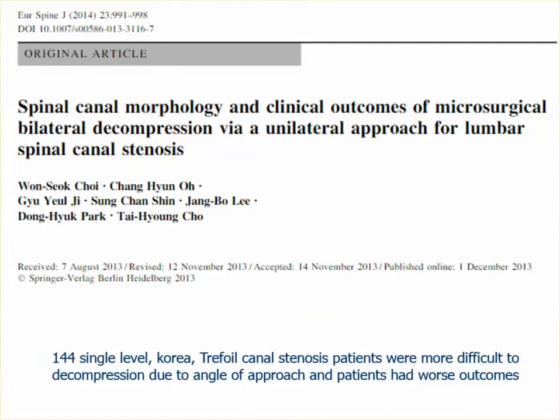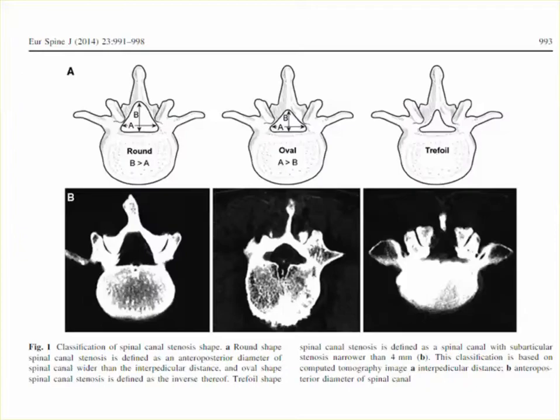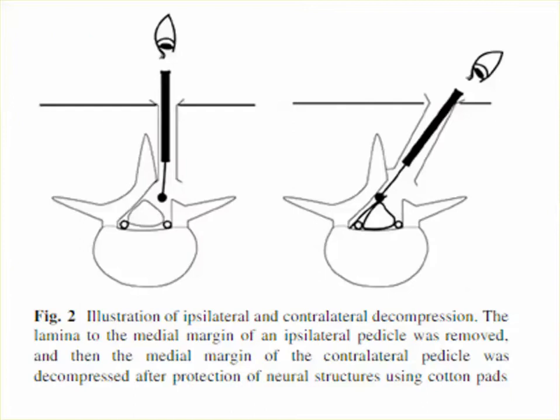And these are just articles reviewing the technique. The reason why I put this up is it shows you how you do it. You just open up one side, and then you turn the table, and you decompress the other side. So it kind of shows you how you open up the spinal canal, keeping everything intact.